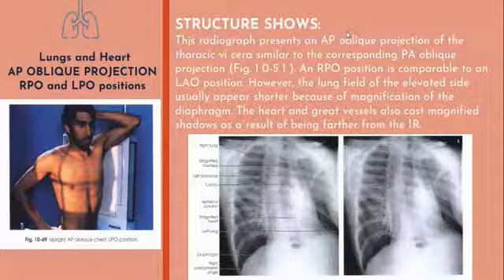So in this radiographic image, we need to clearly demonstrate the following. For both lungs, we need to demonstrate the entirety, and the trachea filled with air must be seen here. Then the visible identification markers, the lung fields and the mediastinal structures must be seen.